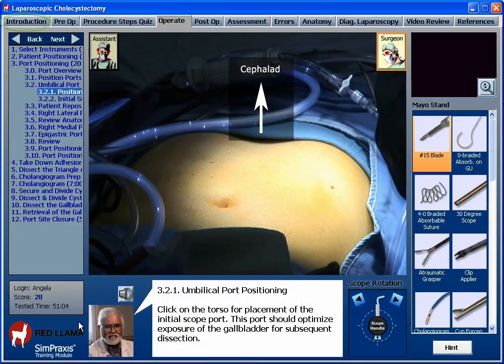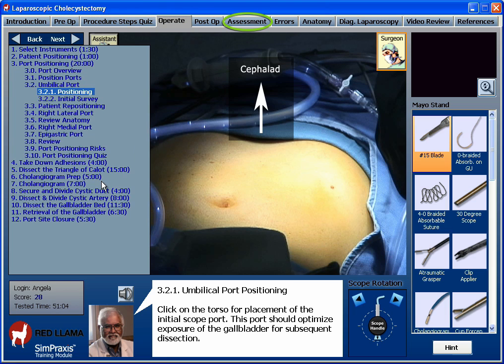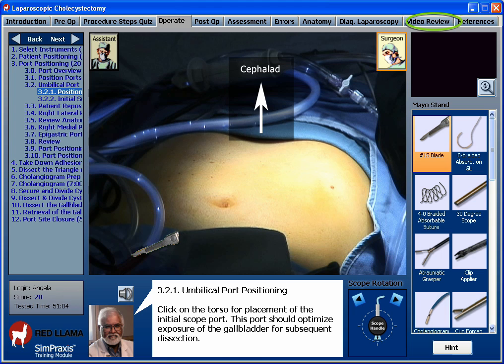Each procedure is broken into logical, interactive steps. The trainer takes you through the entire procedure in a step-by-step interactive fashion. As you move through the procedure, you will make critical choices in key operative management decisions that require you to recognize tissue planes along with visible as well as hidden anatomic structures. Common pitfalls of the surgery are also demonstrated. Oral, written, and video descriptions of each step are provided to optimize the learning opportunity.